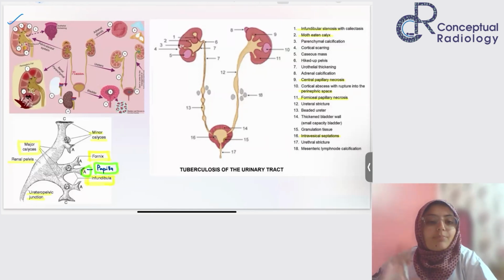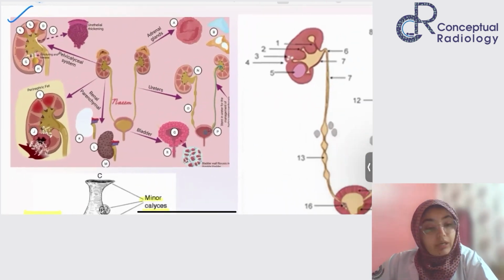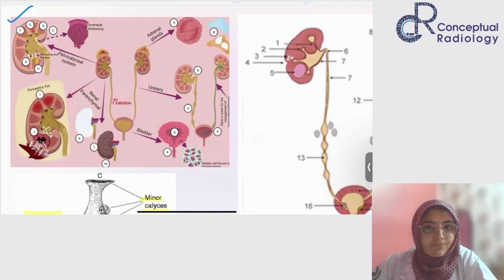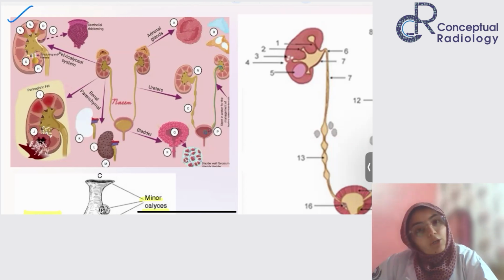Okay. So what is the myriad of findings? We have to see, it is renal tuberculosis. In renal also, there is one thing, that is the renal parenchyma, as we discussed. So in renal parenchyma comes the cortex and the medulla. Just remember the cortex and the medulla are part of the renal parenchyma. After that comes your collecting system, that is your PCS, the pelvicalyceal system.